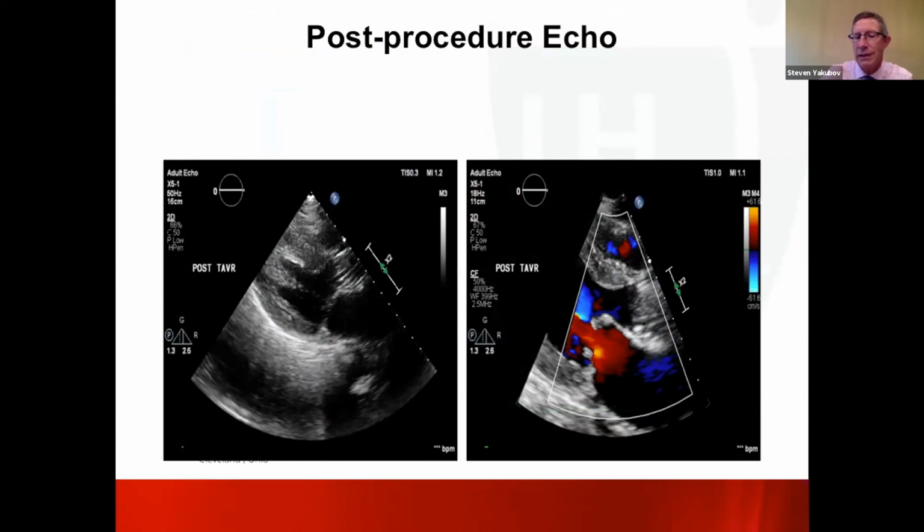If you feel like you need to post-dilate and you're already at +2, how do you prevent that thing from migrating into the greater vessels? So it's interesting because my fellows, and when we have our courses here, people ask me this question, right, Stephen? So do you fear to post-dilate a valve that is implanted high? I don't fear. I respect the fact that the valve is implanted high, right? So if I have to post-dilate, I will definitely post-dilate.